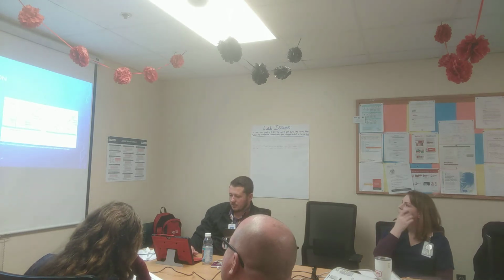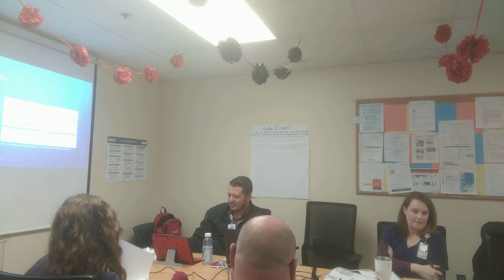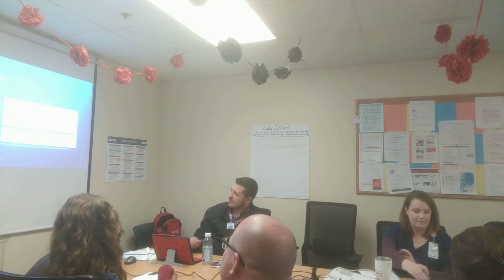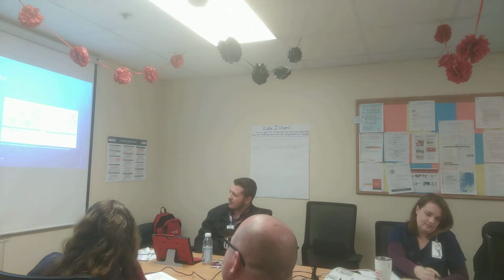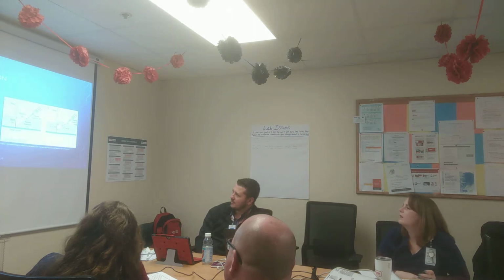This next slide is showing your angle of insertion. So to answer y'all's question, 45 to 65 degree angle is used. That's a lot steeper than we normally think of, and we'll see a picture in a second of that angle. So 45 to 65 degrees is pretty steep. A lot of nurses, when you first start out doing this, don't like that kind of angle, but again, it ensures that half the catheter is threaded into the vein once you get to it.